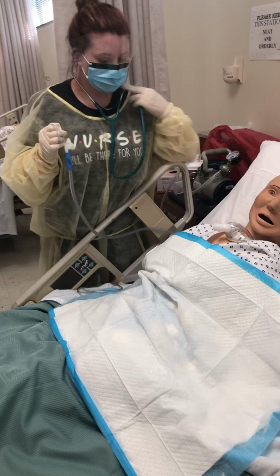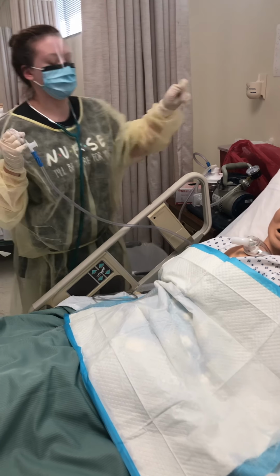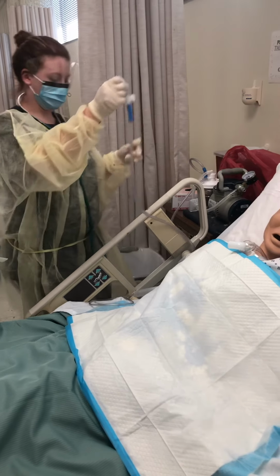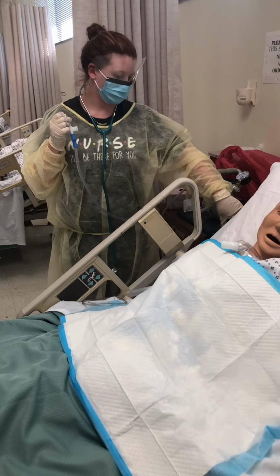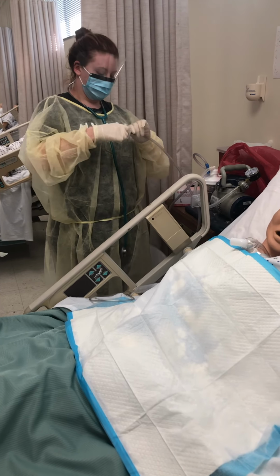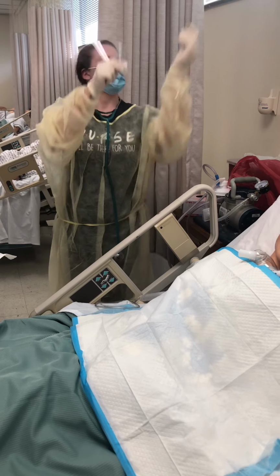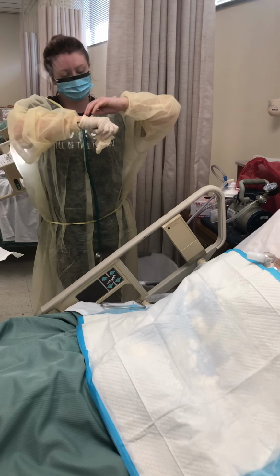Now his lung sounds are clear, and his O2 sat has come up to 95%. So the suctioning was effective. Now I'm going to go ahead and turn the suction off. And disconnect the catheter. And I'm going to take off these sterile gloves with the catheter.